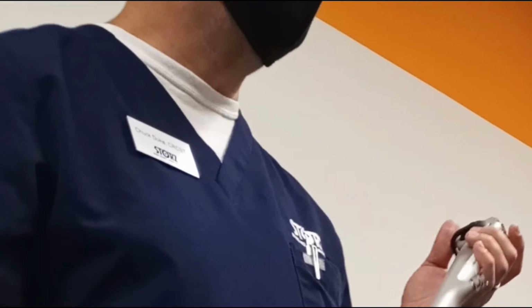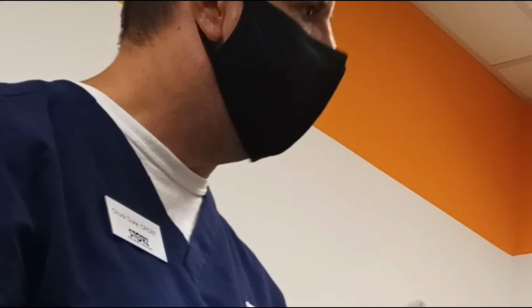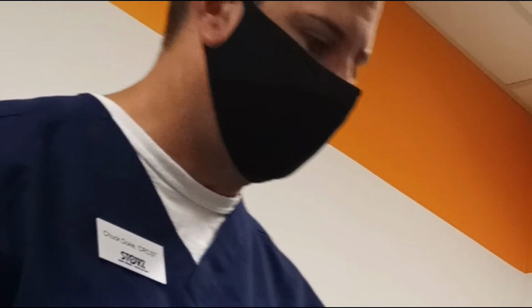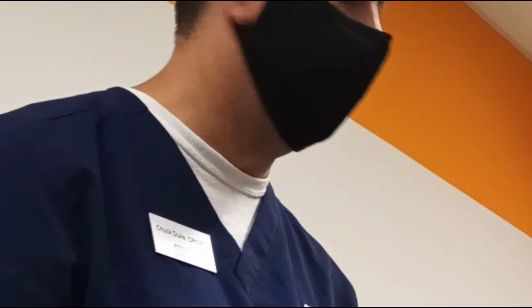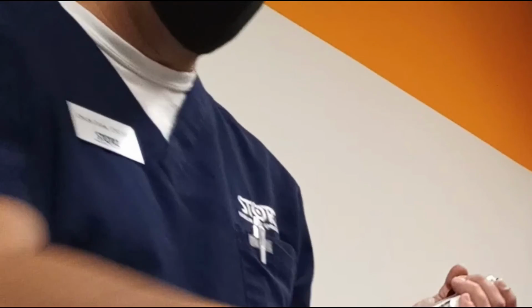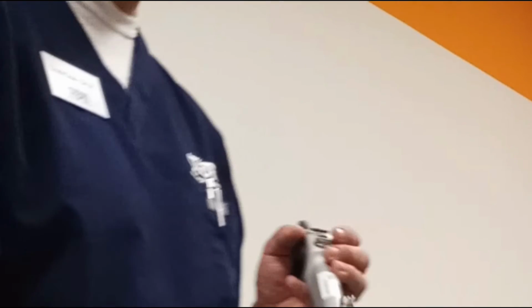You hook it up to the scope buddy? Yeah, that's right. We didn't know that. Not to be funny, seriously, no. I mean, that's just what our IFU says. When you're flushing fluid through a scope, just put the distal tip in the empty sink, so that way any fluid or any kind of debris that's coming out of the scope is not floating. What size syringe? 60. 60.